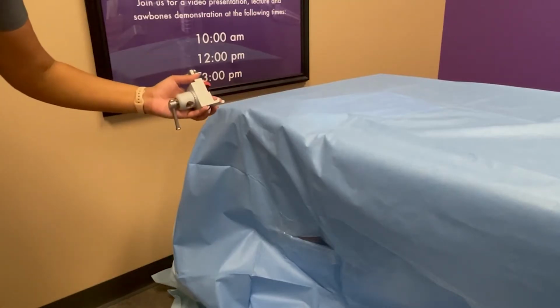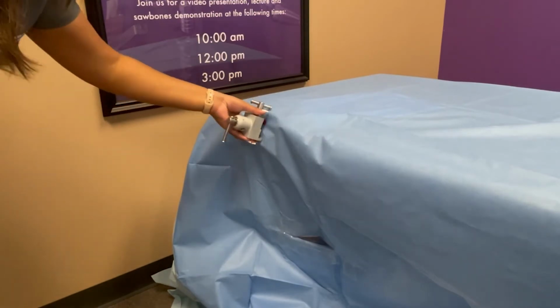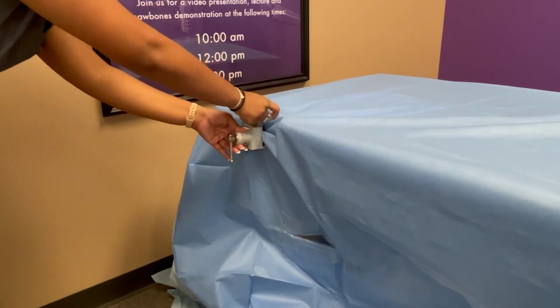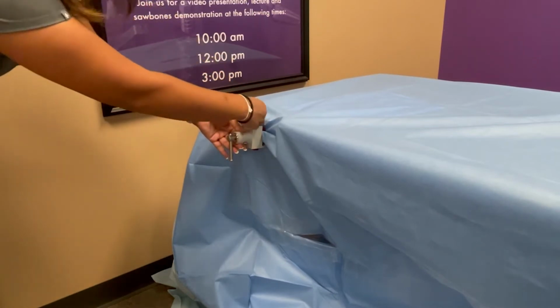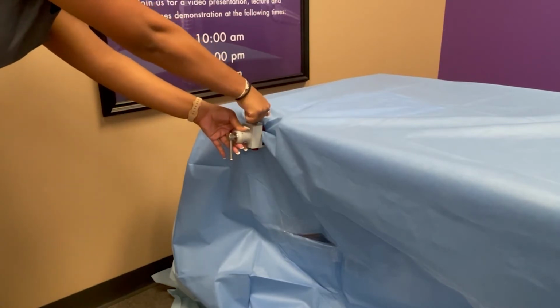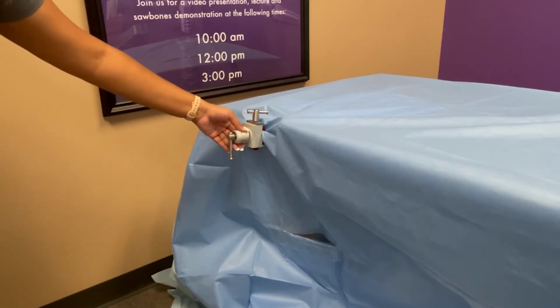Okay, so the first thing that we're going to do is assemble our rotatable table clamps onto the OR rail above the surgical drape. So you're going to clamp it and then turn this knob to tighten it onto the surgical rail. You will be doing this with 2 table clamps. One will be positioned as far caudally and the other one as far cranially as possible, but making sure that you're still able to connect the articulating arms, which we'll be putting on next, to the ring itself.